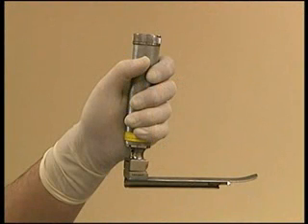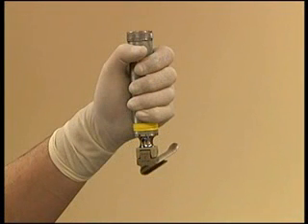The laryngoscope should be used to avoid stimulation of the larynx, which may cause laryngospasm and increased vagal input. The laryngoscope is designed to be used with the handle held upwards to intubate patients in dorsal recumbency, sighting along the blade.